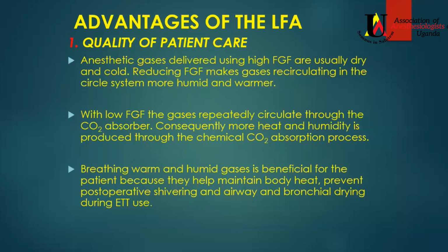What are the advantages of running this? We already talked about some of them, but let's look at one, the quality of patient care. Normally, when you are running anesthetic gases with high flows, these are usually dry and cold, okay? So reducing the fresh gas flow makes the gases circulating in the circuit more humid and warmer. How this happens is, with low flow, the gases repeatedly pass through the CO2 absorber, and we know that reaction is exothermic. So a lot of heat is generated through the chemical absorption of CO2. So the breathing of warm and humid gases is beneficial for the patient because it helps maintain body heat. It prevents postoperative shivering and airway and bronchial drying during ETT use.